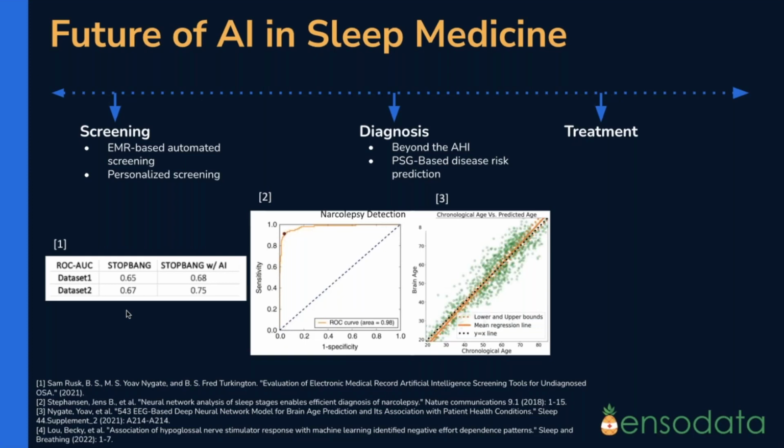The second thing here, and this is a really important point I want to emphasize, is that I'm not familiar with many other healthcare or physical tests out there that record so much information about a patient. Think about it, the average sleep study is between 6 to 8 hours, and it records a vast amount of different signals, whether it's neurological signals with EEG, respiratory activity, cardiological signals with ECG, pulse oximetry, leg movements. This is a lot of data that might take a lot of time to be processed by humans, but not only that, similar to the COVID-19 example that we saw earlier, there is probably a lot more information in that data that we're just not leveraging today.